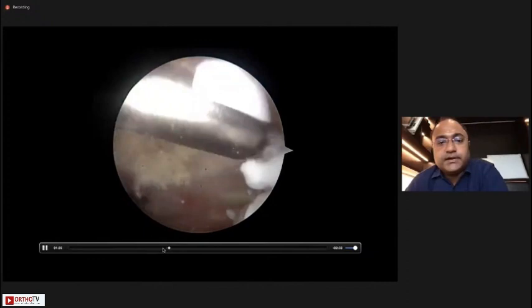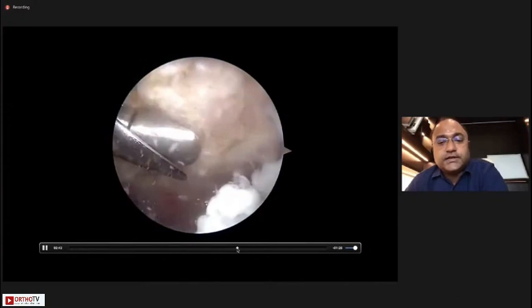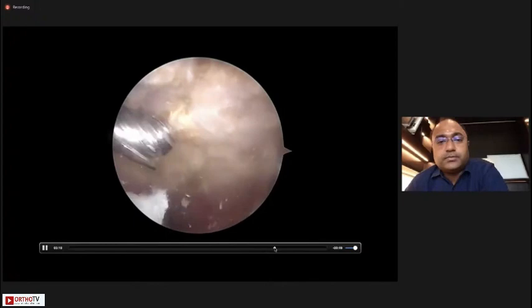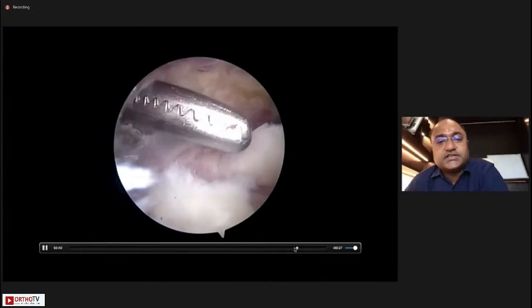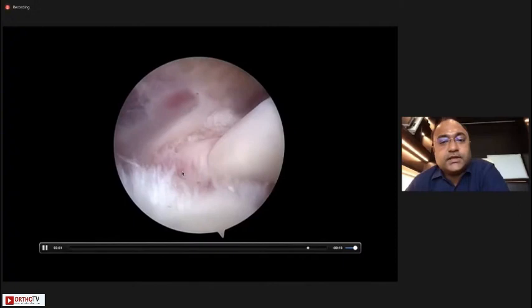Keep the CA ligament intact — just recess it. Then use a bur to clear off the anterolateral corner, making sure not to cut any deltoid fibers — just release the inner deltoid fascia. If there is a keeled acromion, be more aggressive; if there is lateral extension, work on the lateral aspect as well. Clear the lateral bursal extension too, as these patients have a lot of lateral arm pain from bursal inflammation extending onto the lateral aspect of the arm. After the biceps tenotomy, clear out all that lateral bursal extension.